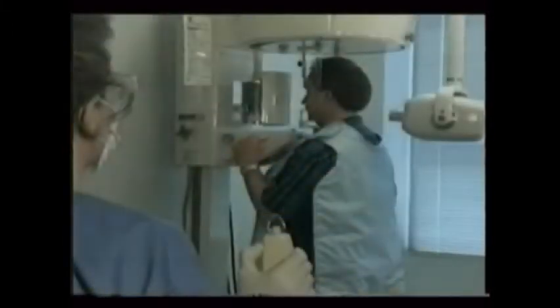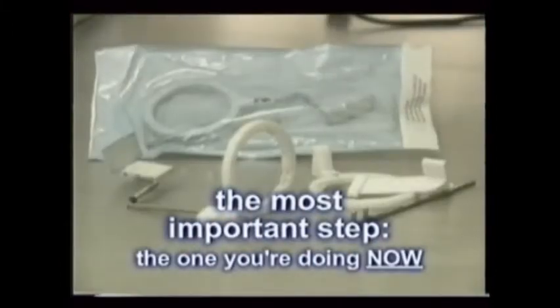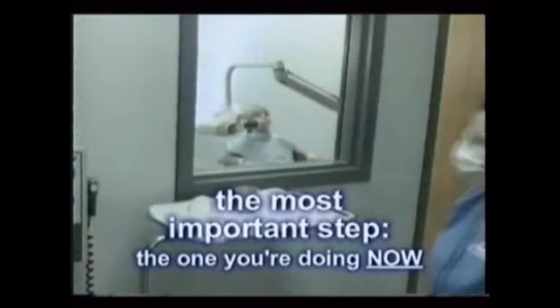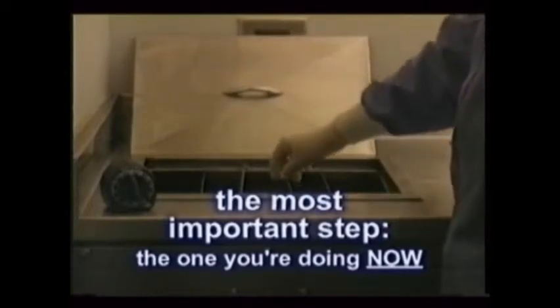Every step of the x-ray process is equally important. Any breach may mean repeating an x-ray, and additional patient exposure is really not acceptable. By understanding certain errors and correcting their causes, you can minimize the patient's radiation exposure.